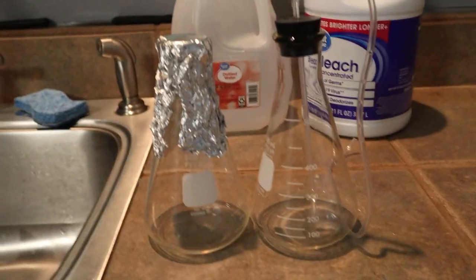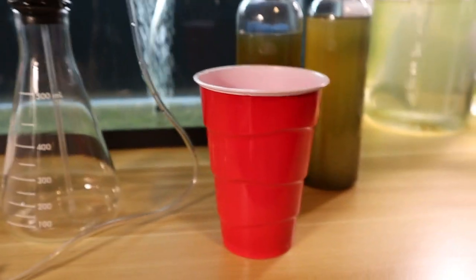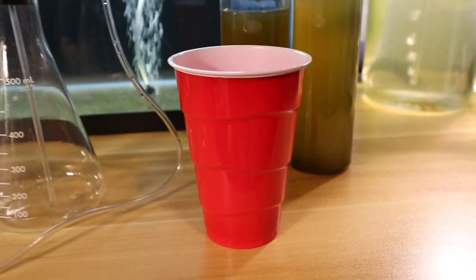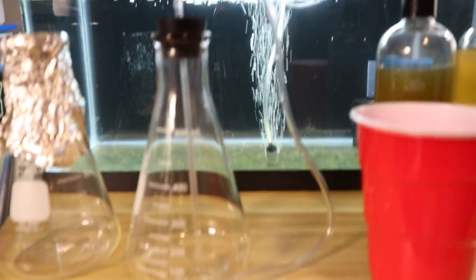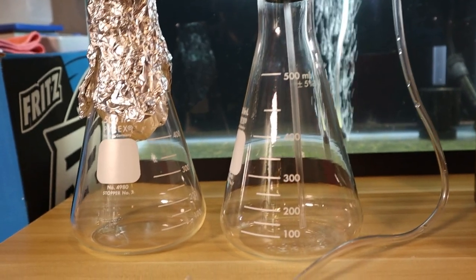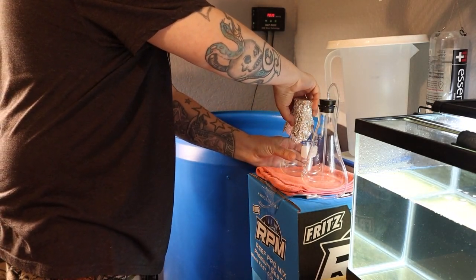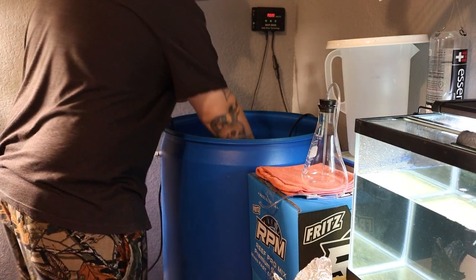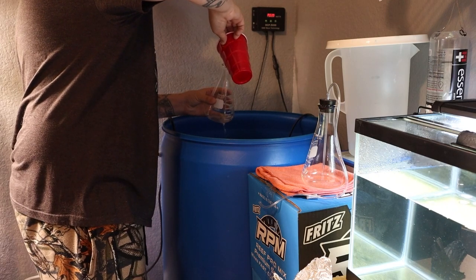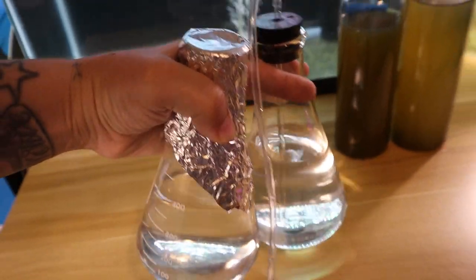Now that these are sterilized to the best of our ability, let's go ahead and add some salt water. I use a clean Solo cup fresh out of the package, never been used, and go to my mixing container of salt water. I'm going to fill these up to the 400 milliliter mark. Now we're going to go boil the salt water — I'll let it boil and check back once it starts boiling.